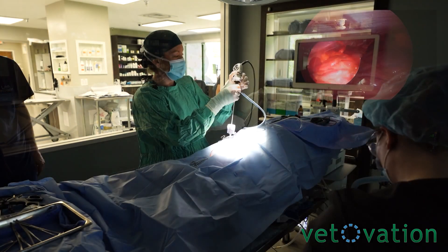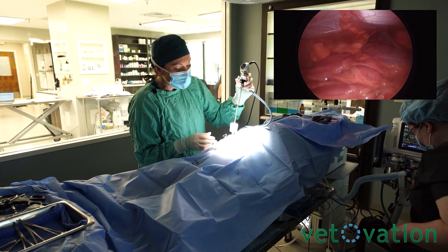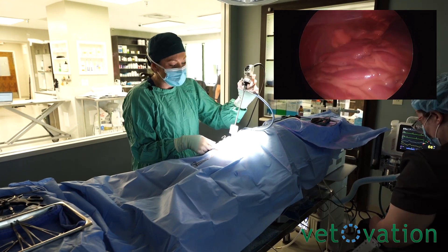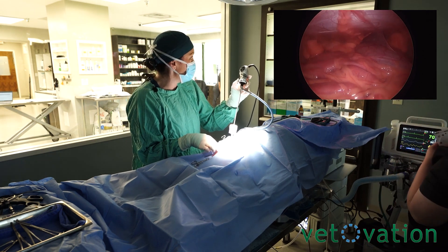Second port under direct visualization. Here we're just trying to do our coddled port. We don't want to go too far in a big girl because your instruments want to be able to reach. So you want to be able to get all three of your ports in.